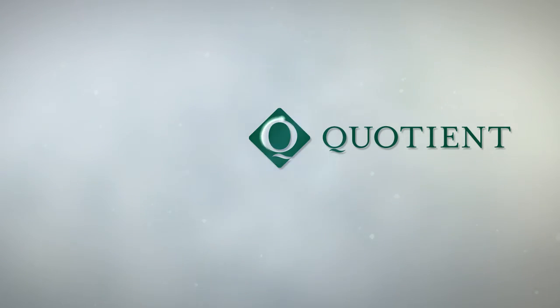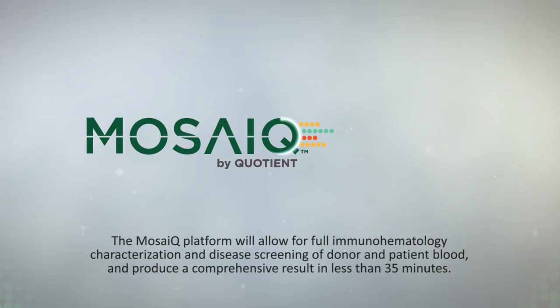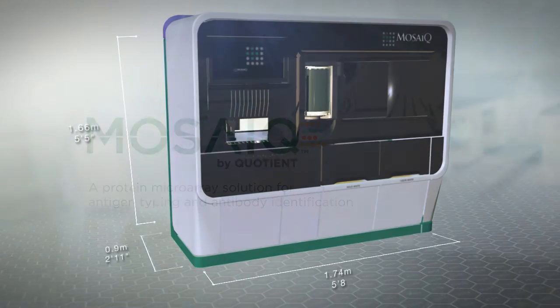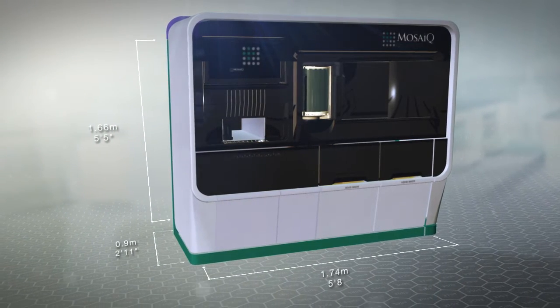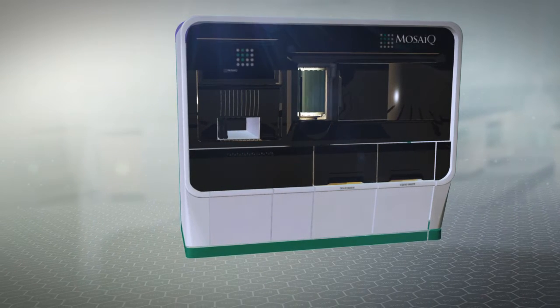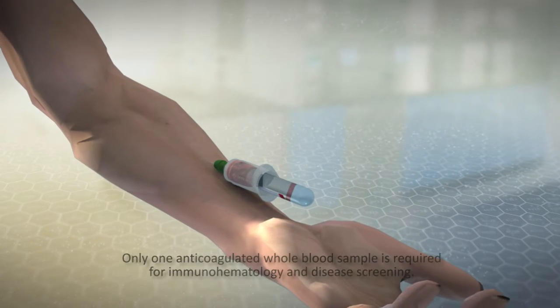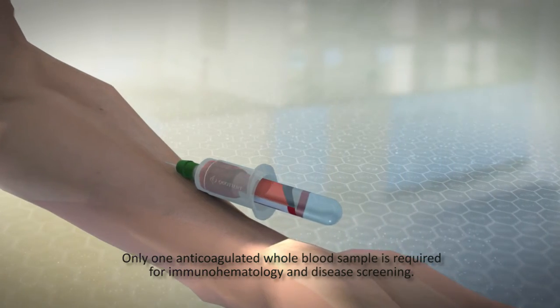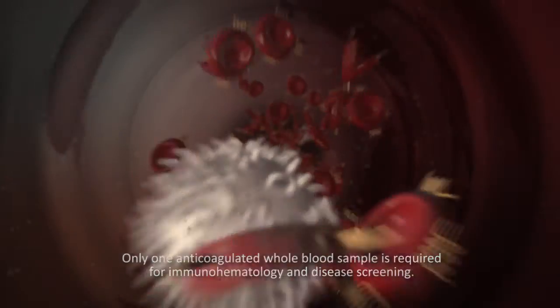Introducing MosaiQ by Quotient. The MosaiQ platform will allow for full immunohematology characterization and disease screening of donor and patient blood and produce a comprehensive result in less than 35 minutes. Only one anticoagulated whole blood sample is required for immunohematology and disease screening.